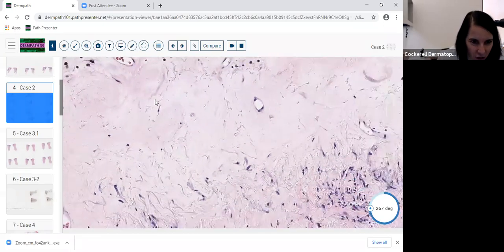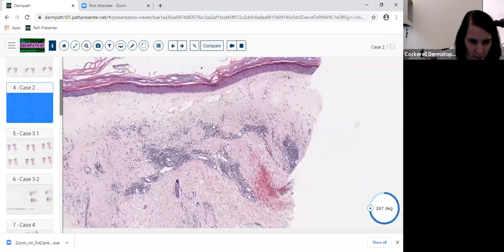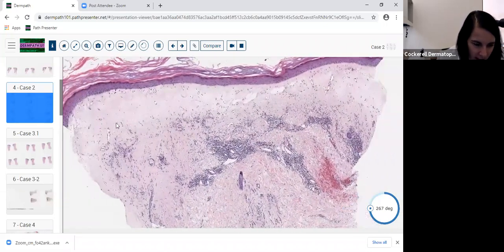The other key feature is the hair is wiped out here. The appendages are just wiped out. You don't see any here. And this was hair-bearing skin.